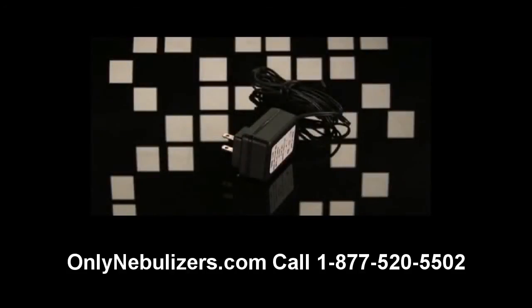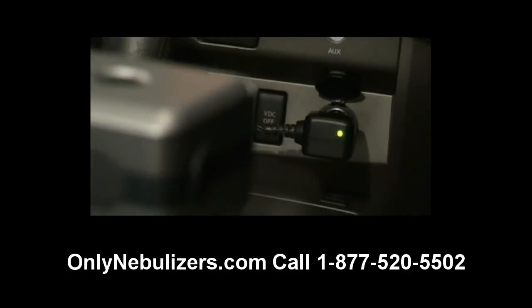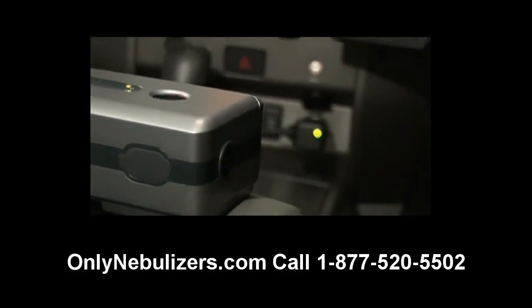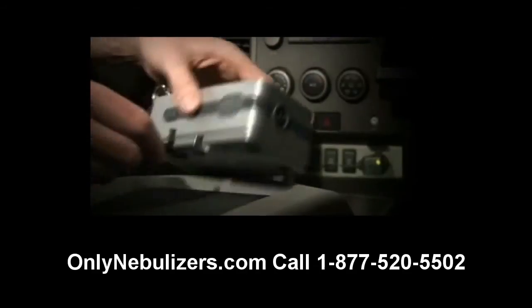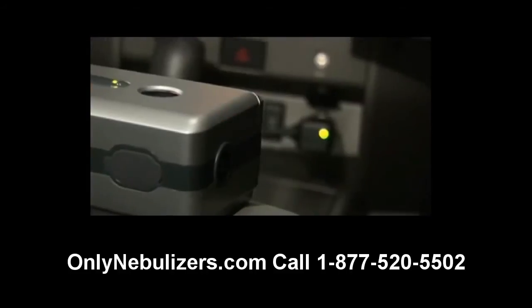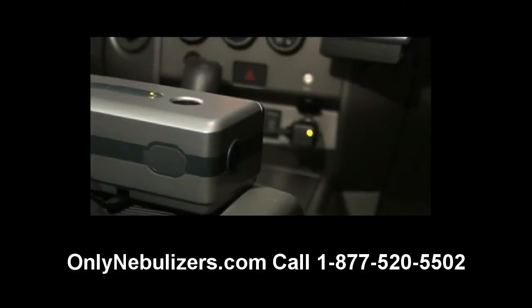Your Traveler can also be powered by your 12-volt DC or cigarette lighter outlet in your car. Consult your automobile's owner's manual to ensure the outlet is indeed 12 volts. To use a DC outlet, plug the DC adapter into the outlet and then insert the opposite end of the power cord into the power socket of the Traveler. The power indicator light will display green when the unit is turned on.